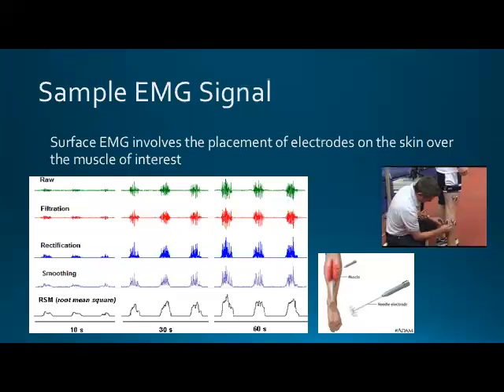People have done comparisons, if that's what you mean. They'll do the same muscle actions with surface versus intramuscular. Is there a huge discrepancy? You'll get different measures because it's not necessarily a global estimate. It kind of depends on what question you're trying to ask, like which one would be best.